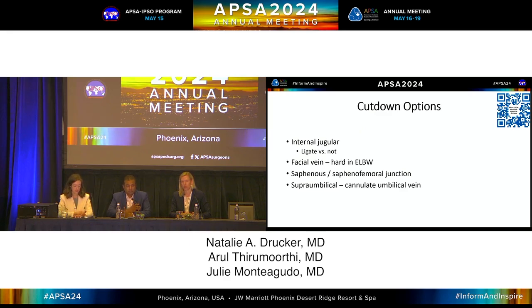Stay extraperitoneal, find the vein, same thing, control, and you can actually get into it as you would normally make a venotomy, and you pass a PICC catheter, it comes from 1.9 up to 5 French. You get an x-ray, see if you can get it all the way up to the atria. If not, back it off and make it a high lying. And if all you have to do is get a couple centimeters in and tie it off, you now have a nice big IV to get access and get in.